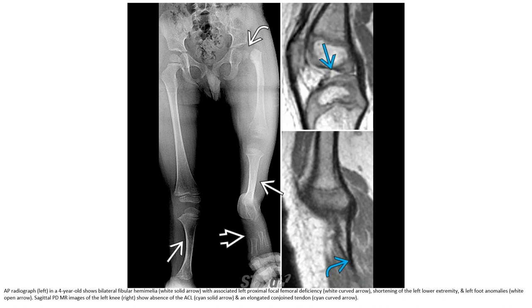AP radiograph in a 4-year-old with bilateral fibula hemimelia and associated left proximal focal femoral deficiency. There is shortening of the left lower extremity and left foot anomaly. A PD-MRI image of the left knee shows absence of the ACL and an elongated conjoined tendon.